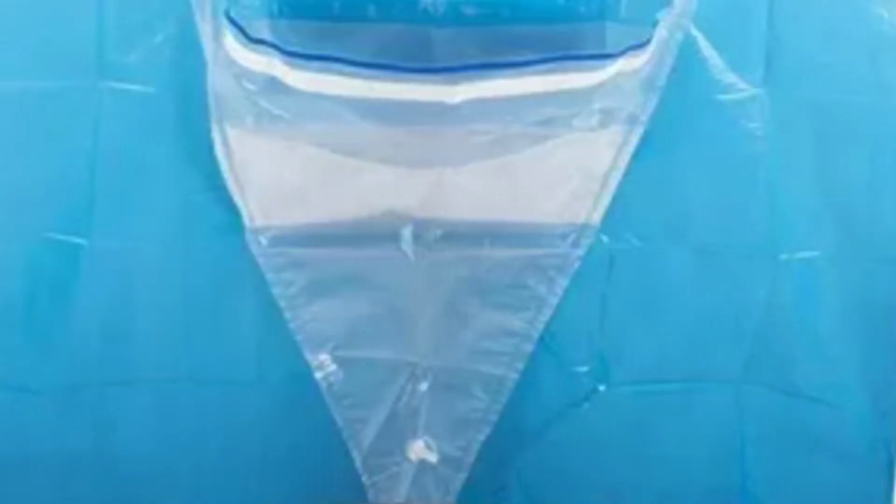I also wanted to show you the impervious drape that covers our vaginal delivery table, and it serves as a tablecloth. And everything gets placed on top of this, and it's fairly thick so it doesn't rip or tear. Typically, the healthcare provider also will use something called the under the buttocks drape, and it has a transparent pouch to catch blood and fluid. There's an example of it on screen because I just didn't have it on hand to show you.